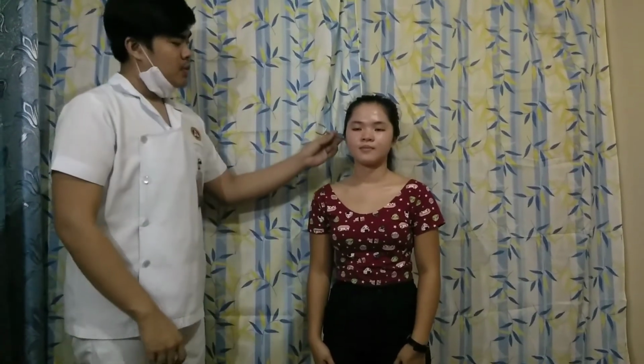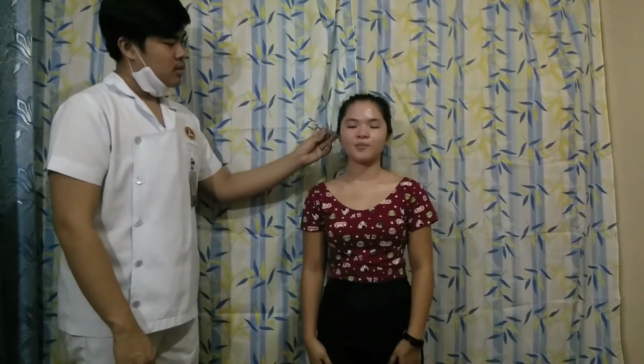We're now going to do the Rinne test. It is the comparison of air conduction and bone conduction. We're going to place the tuning fork on the mastoid part of our client. Before moving the tuning fork, we need to make sure that the client will not hear any vibration. Ma'am, do you hear any vibration? Wala po. How about now? Meron po. The air conduction is twice as long as the bone conduction.